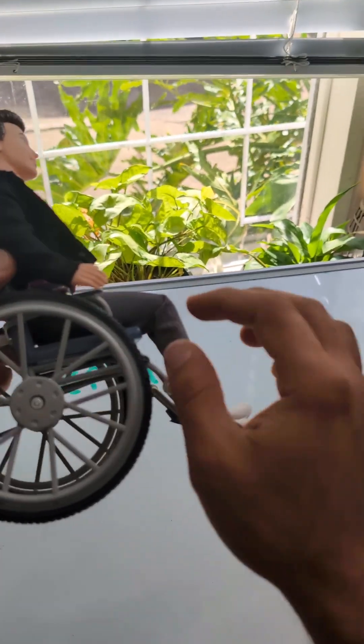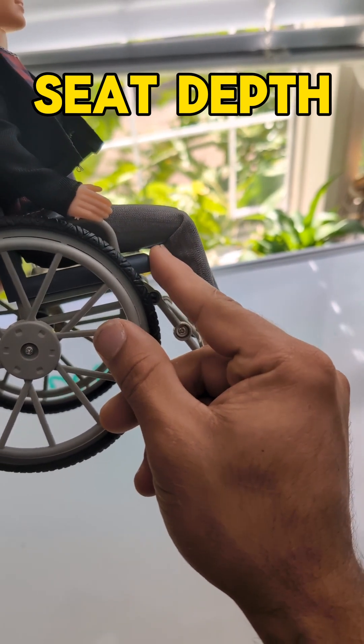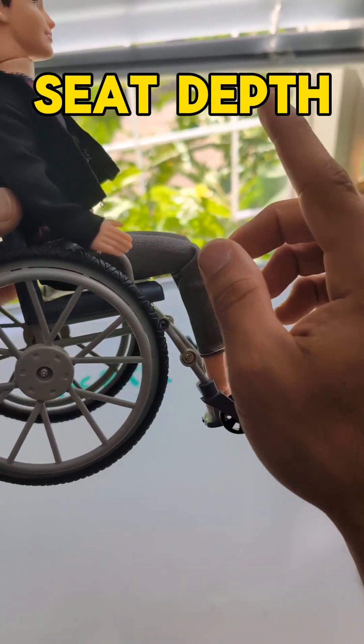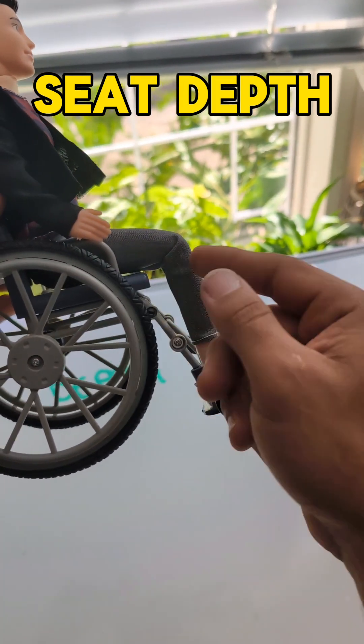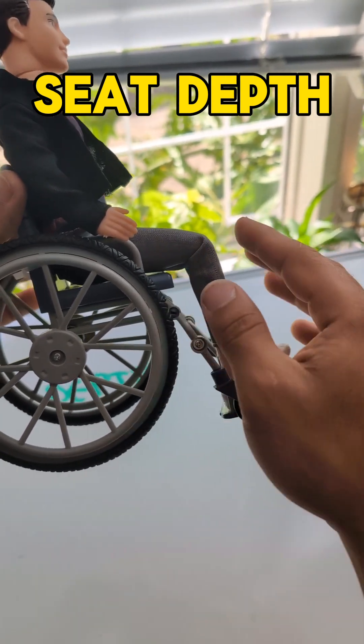Another thing you want to check is the seat depth. On this chair it is perfect — there is a small gap between the knee crease and the cushion. If the seat depth was too long, this client would never be able to come all the way back into the chair, so if the seat depth is too long, you're going to have problems.